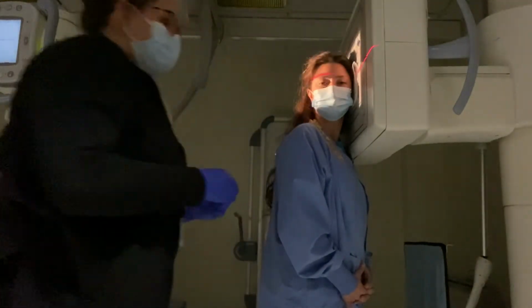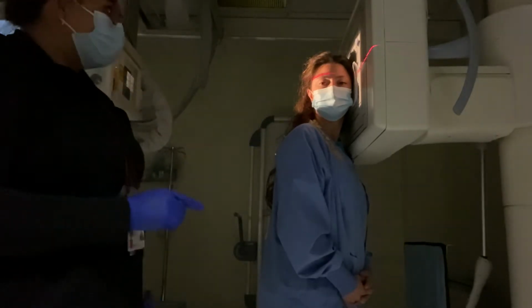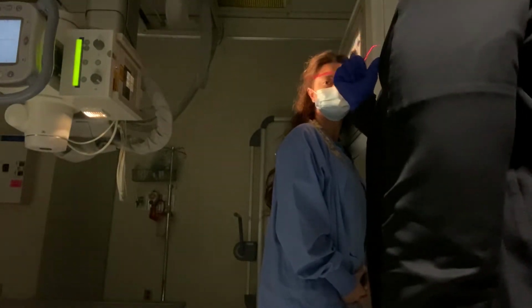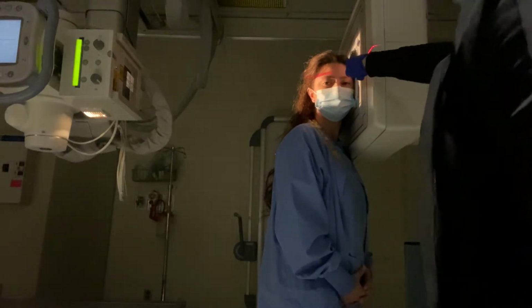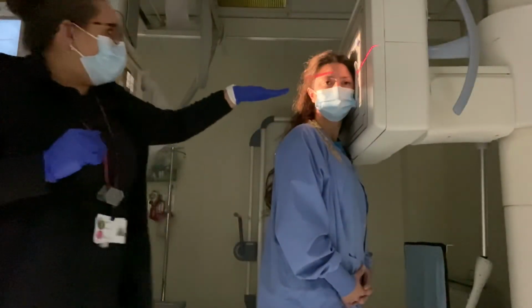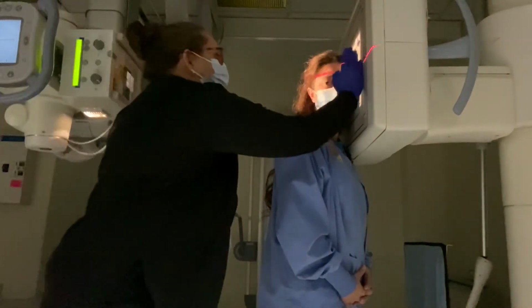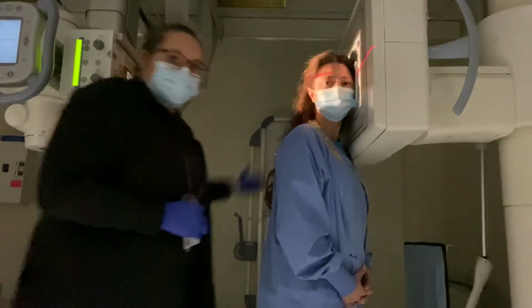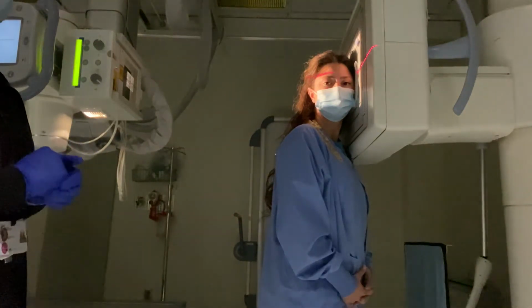So I'm going to change my marker, make sure it's on the anterior side. I want to make sure that my patient has no rotation or tilt. So I need to get directly in front of them and look at them, and then I'm going to have you tilt your head that way just a little bit. Their interpupillary line should be perpendicular to the IR, so an imaginary line between their pupils. There should be no tilt or rotation. And then their IOML should be perpendicular to the front edge of your cassette here. So you want to make sure that you get the top of the skull and the posterior portion of the skull on there, and you'd have your patient hold nice and still just like that.